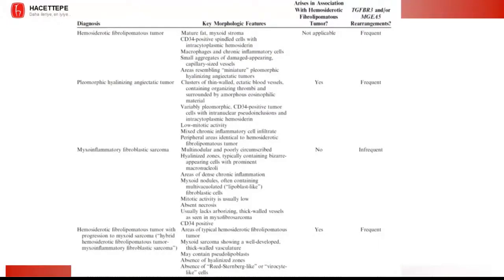So this is again a table from that review, and it might help when you try to diagnose this kind of case. And this is a differential diagnosis with key morphological features.